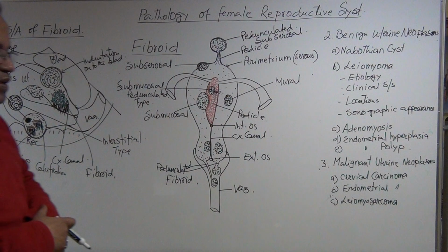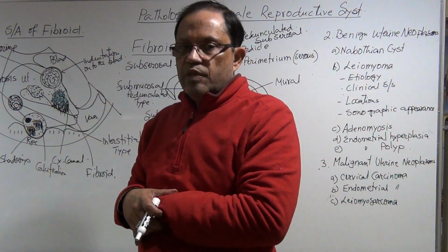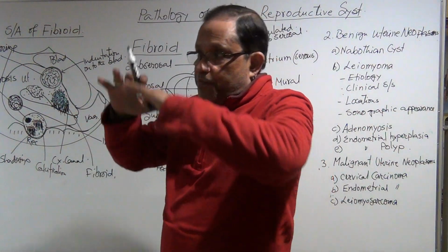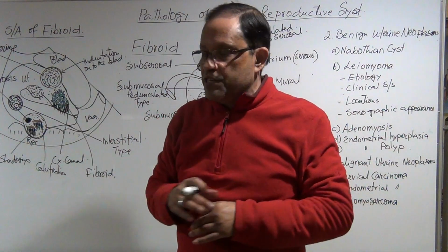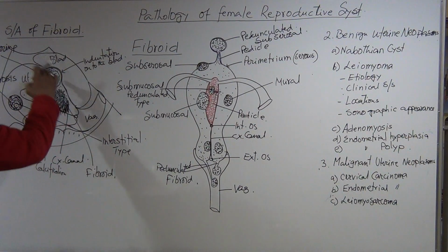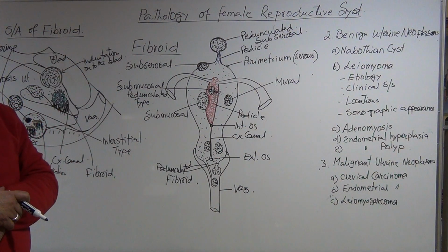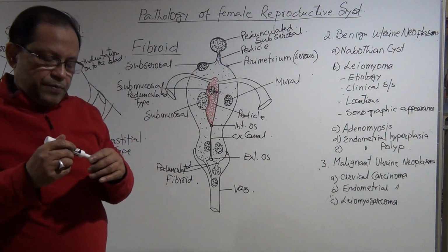Old fibroid and is growing faster. See the irregular border? It may look like a malignant. And because of this type of borders and surface and the heterogeneous look, if there are multiple of this type of fibroid, the whole uterus gets deformed with a lot of shadowing, and you cannot see the uterus very clearly.